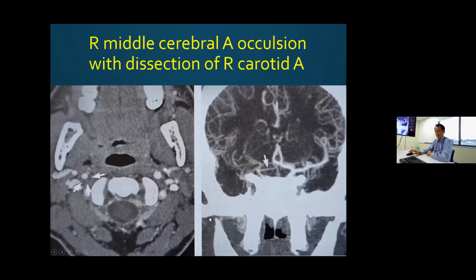And so again, the angio shows, compared to the left side, the M1, M2 branches, but on the right side here, you don't see them. And see this round oral cavity, uvula here, there's the tongue base, lingual tonsils here, palatine tonsils on both sides. And this pharynx here, I will tell you about later.